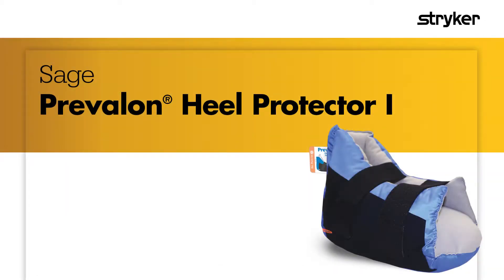The Prevalon Heel Protector 1 helps minimize pressure, friction, and shear on the feet, heels, and ankles of non-ambulatory patients. It completely offloads the heel for continuous pressure relief.